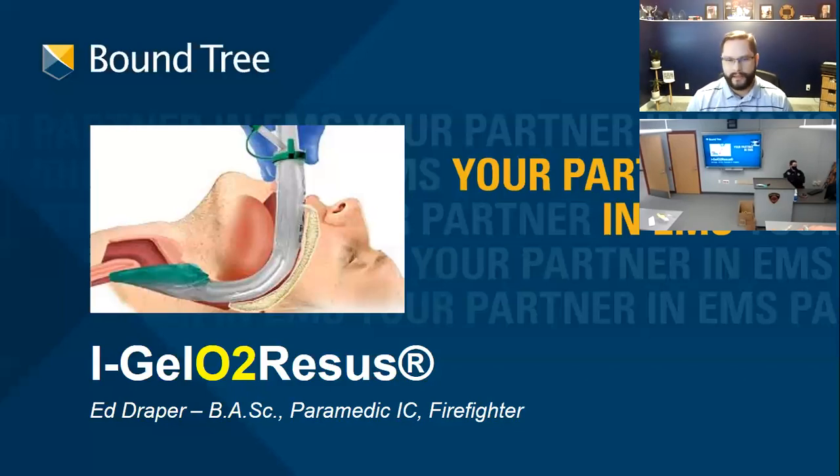The iGel is used in a scenario where you're not intubating. The paramedic will tell you intubation is always the gold standard — it's the one we want to do. The BLS airway is designed as a rescue airway for situations where intubation may be difficult or there aren't enough hands on scene. I'm not saying BLS airway is better than actual intubation.